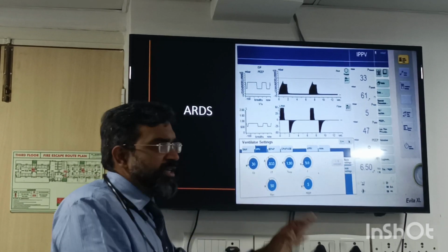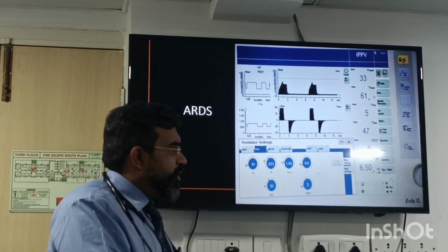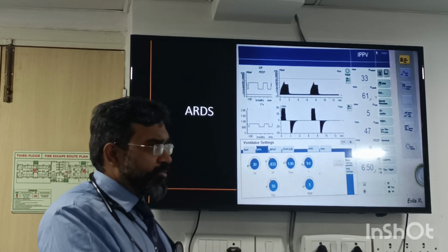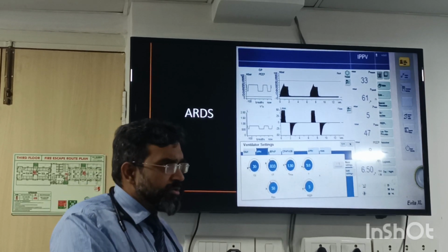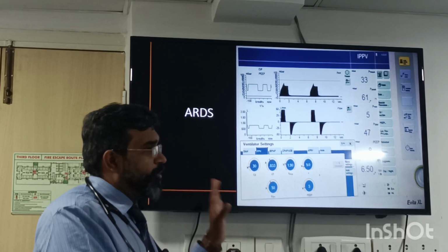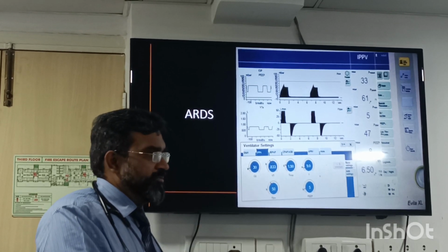So this is the mode that was set by Supriya some time ago, and you came in on your over and you saw this. Do you think that there is any problem? Peak pressures are elevated, along with the plateau pressures. What is my problem? First, find my major problem.